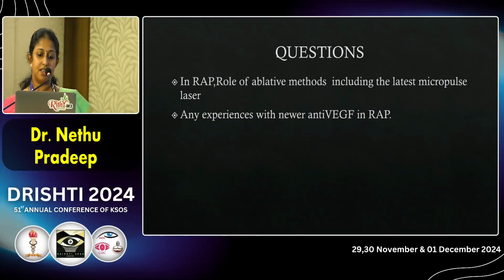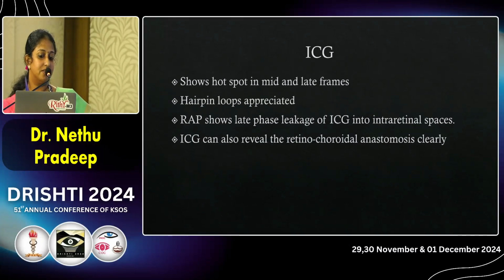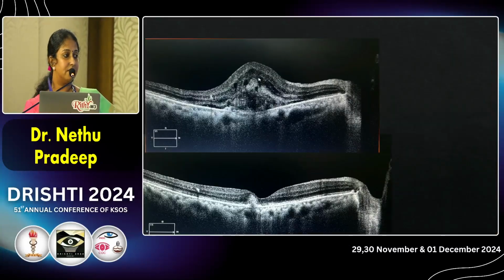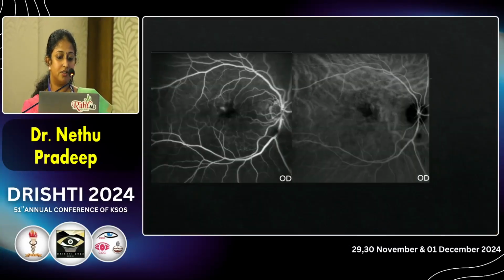So I would like to ask a few questions to the panelists. First is, what is the role of ablative methods, including the latest micropulse laser, madam? So I think we'll go to the diagnosis first, because that will be more important for the audience. Let's go to that OCT picture. The previous case, first case.